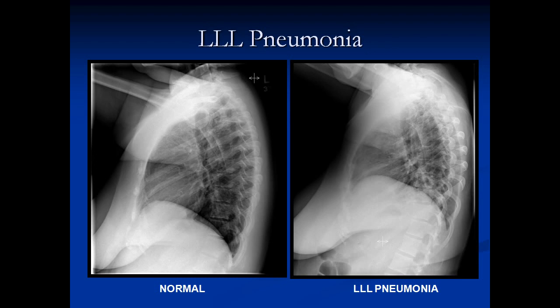On the normal lateral film, you can see the right hemidiaphragm going all the way to the front and the left hemidiaphragm going to the heart. On the left lower lobe pneumonia lateral view, you can see all of the right diaphragm, but you don't see any left diaphragm — there's consolidation on top of that diaphragm, so we've lost the interface between air and soft tissue.